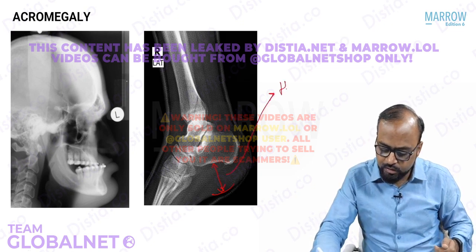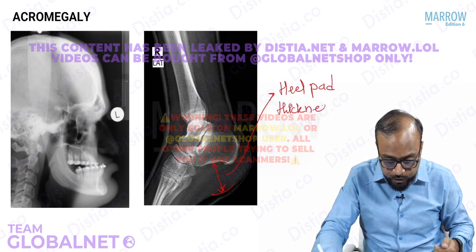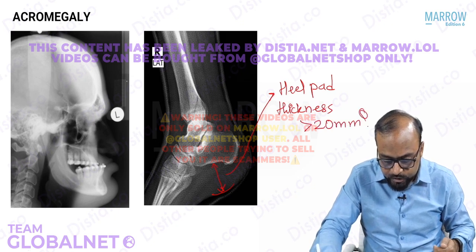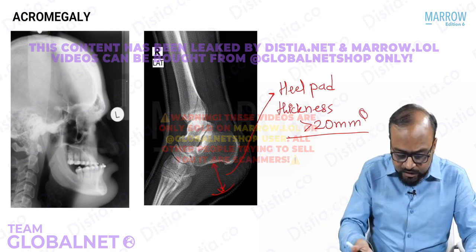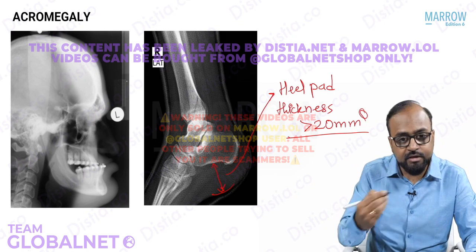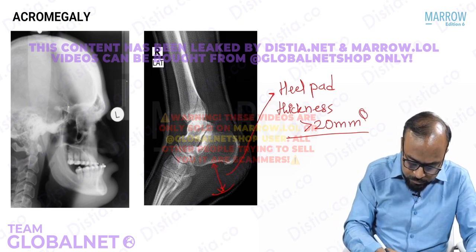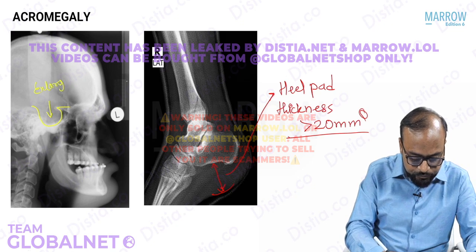So a heel pad soft tissue thickness of more than 20 mm is considered to be a diagnostic feature of acromegaly. Now what happens in acromegaly is that growth hormone is being secreted from where? From the pituitary. So there is an adenoma within the pituitary. The pituitary is located within the sella. See how large the sella has become. So an enlarged sella, as you can see here, right?